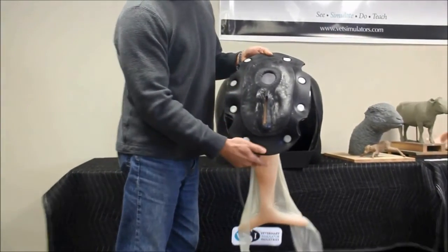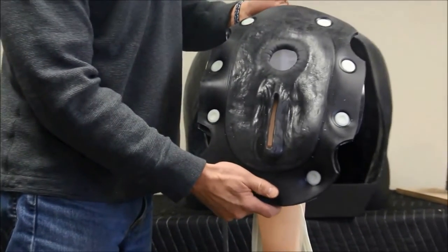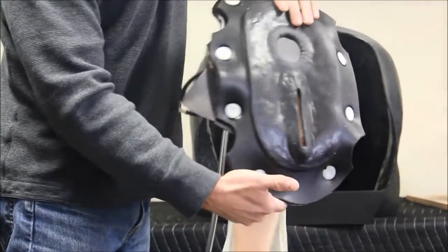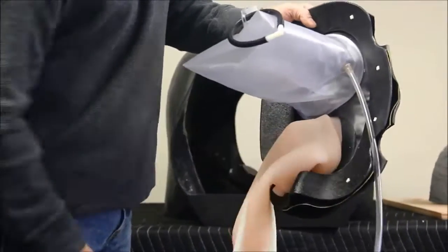This is the Equine Palpation Assembly, which is also a replaceable part. It has a soft perineum panel with anal and vulva openings, which is mounted to an ABS plastic ring via plastic fasteners.